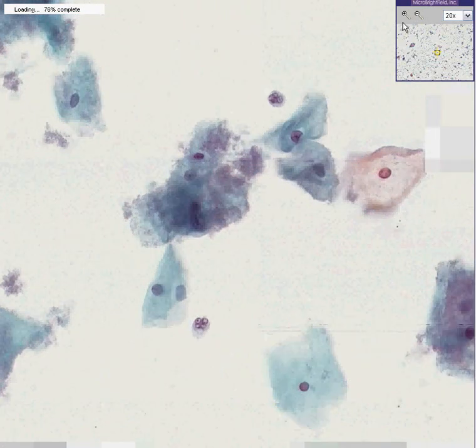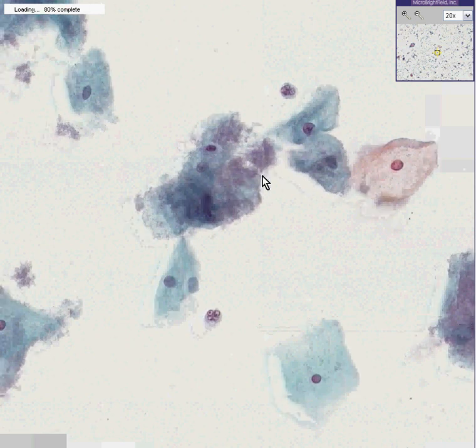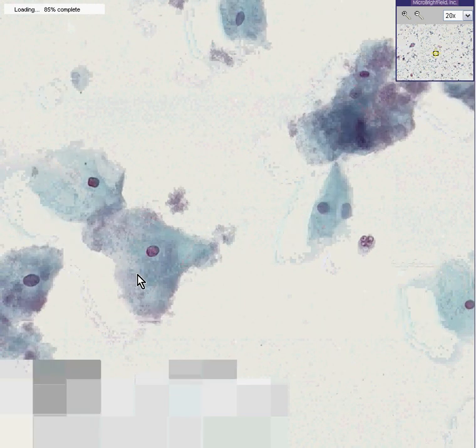smear, and I'm sorry we can't go higher than this 20x over here, whenever you see a little fuzziness in any of the cells, especially the superficial cells, most likely they represent bacteria. A fuzzy area like this is almost certainly a lot of coccal bacteria, just involving the cytoplasm of these superficial epithelial cells. Sometimes you're lucky enough to see little rods, and I wish I could show you those.